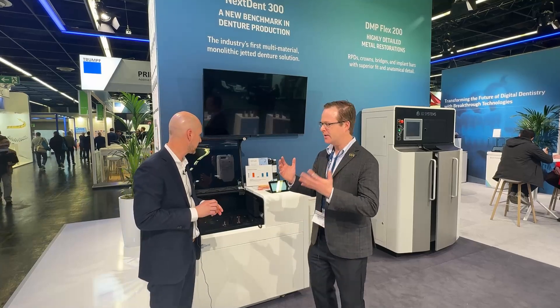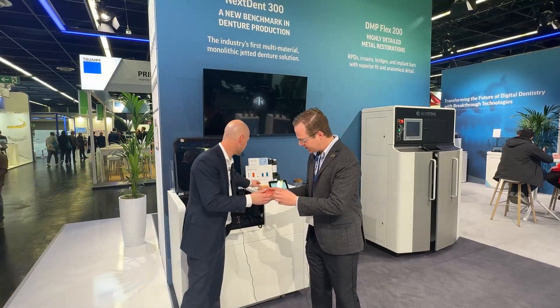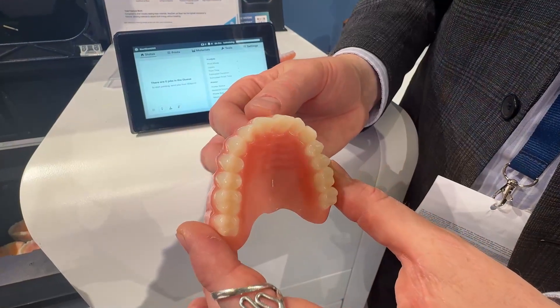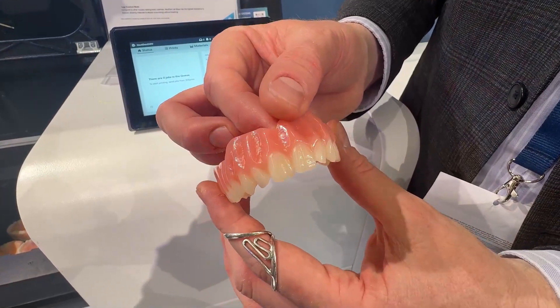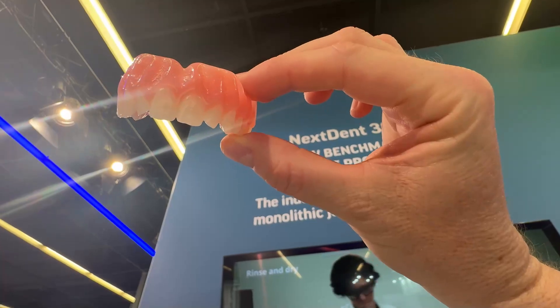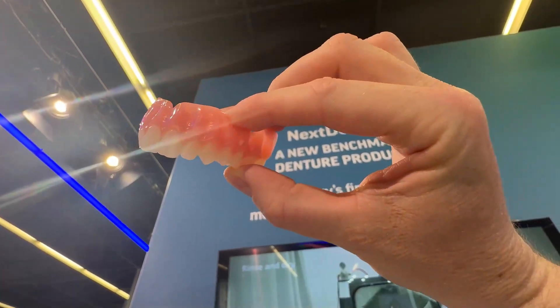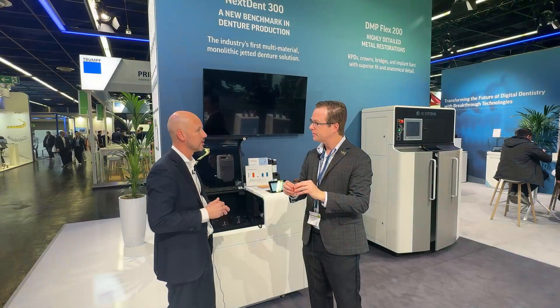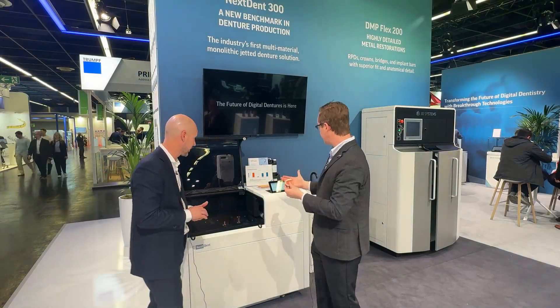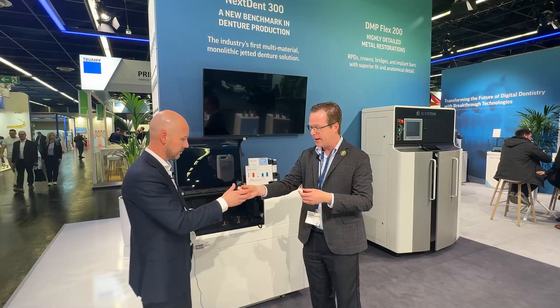Amazing. So Sten, let me see the denture for a second. This is really a very attractive denture. This was printed on the Nexdent 300? Exactly, on the Nexdent 300. Look at the translucency of the tooth material — combined with a beautiful tooth shape design with a lot of structure on it, it really comes to life. It really is an amazing denture. This is a really cool-looking machine as well.